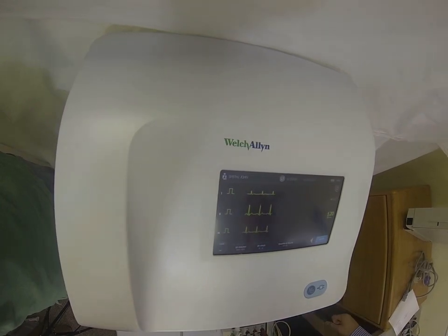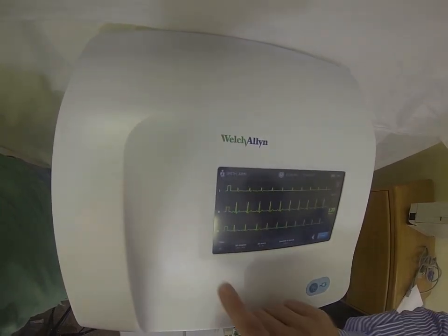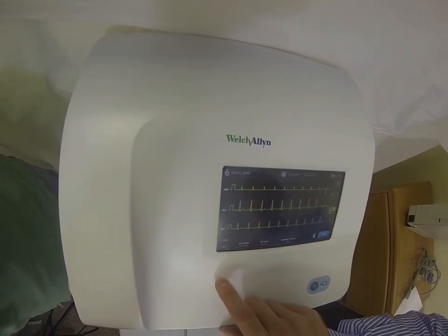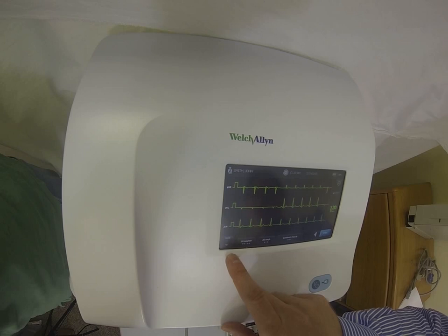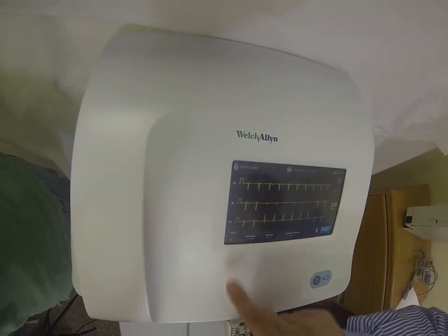Once the patient is hooked up, it'll take us to our live lead preview screen. This will show three leads at a time, and you can actually view any three leads that you would like, just by changing this view here.